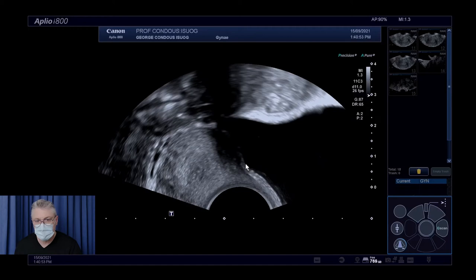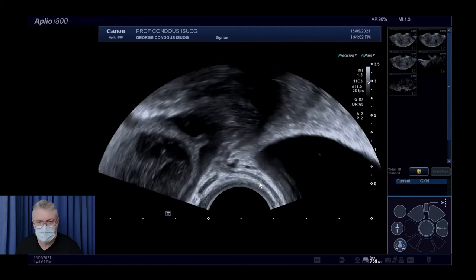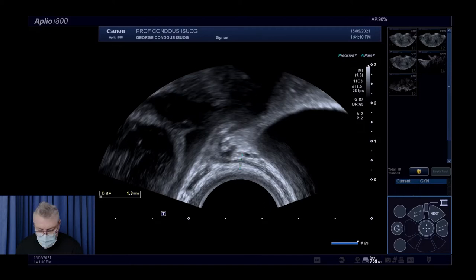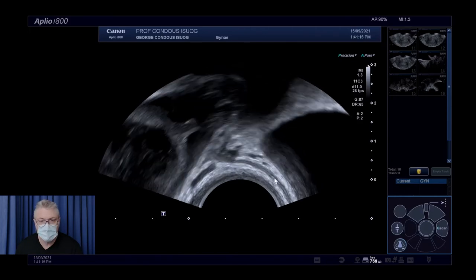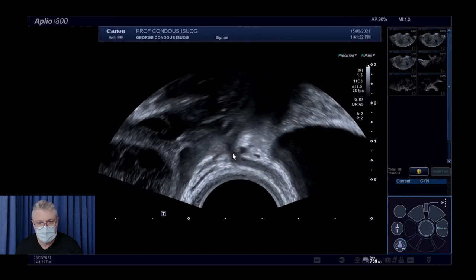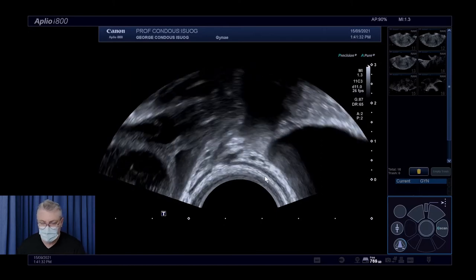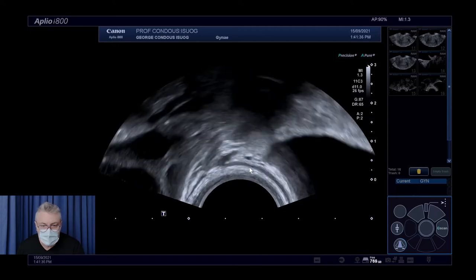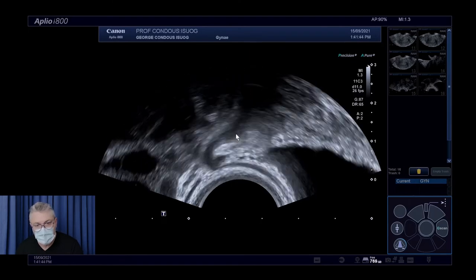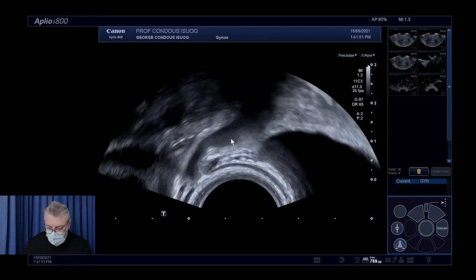Coming back to mid-sagittal and swinging to the left contralateral side, the left ureter is sitting very close to the tip of the probe, measuring a normal 1.3 millimeters — great. We wait to see urine production and watch that ureter do a little right-hand bend. A beautiful demonstration by our young patient on cue — your kidneys are working beautifully. We're happy with both the right and left ureters; we can see urine coming, then the ureter contracts nicely to squeeze urine toward the bladder, with no signs of compression distally or in the mid-segment.